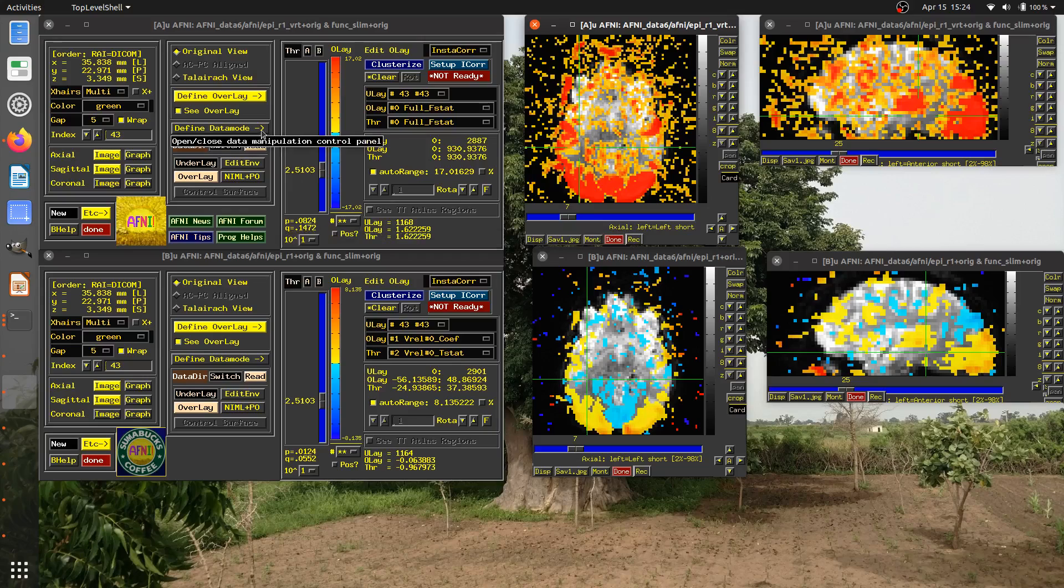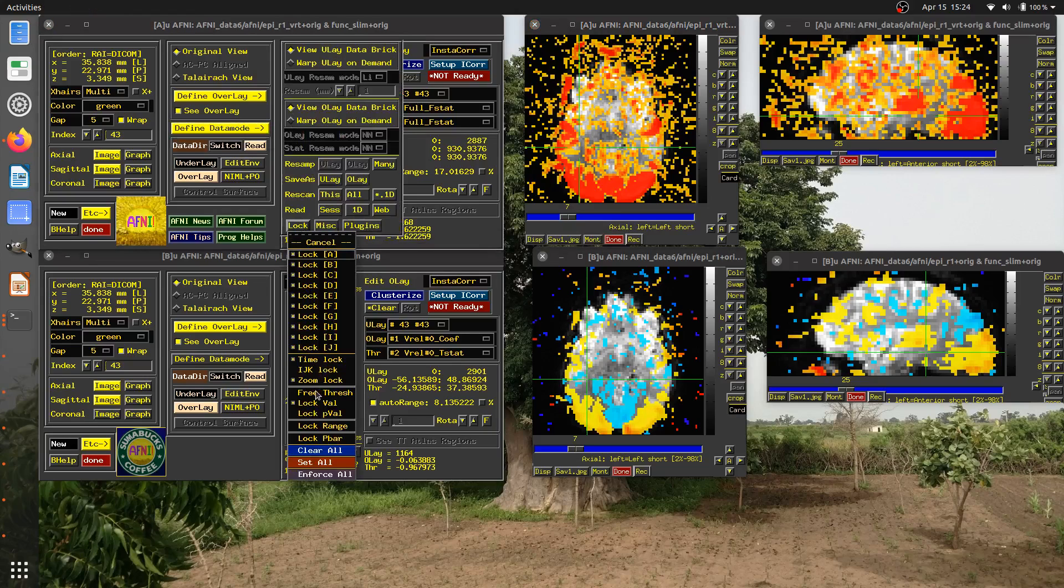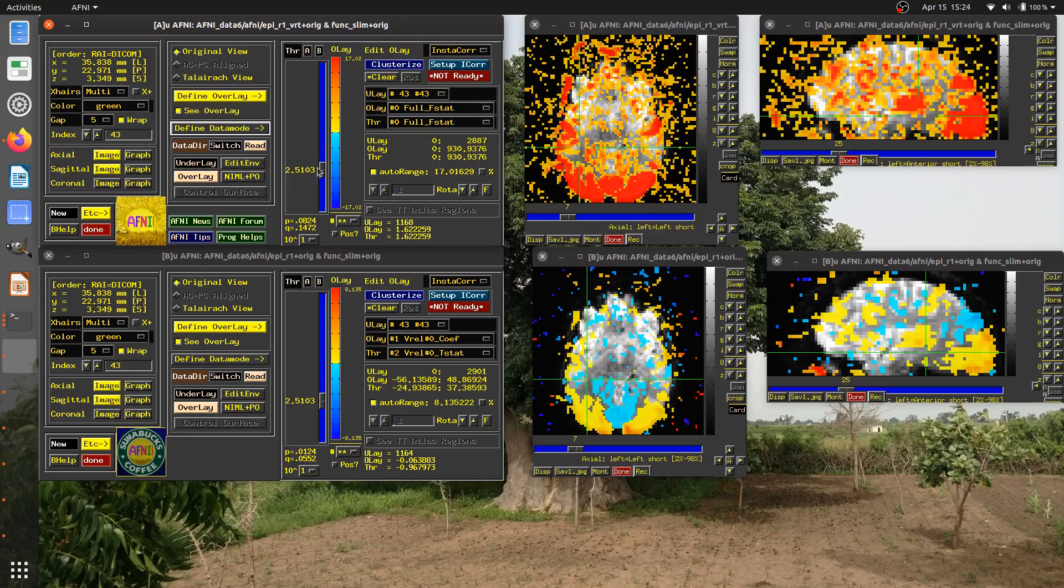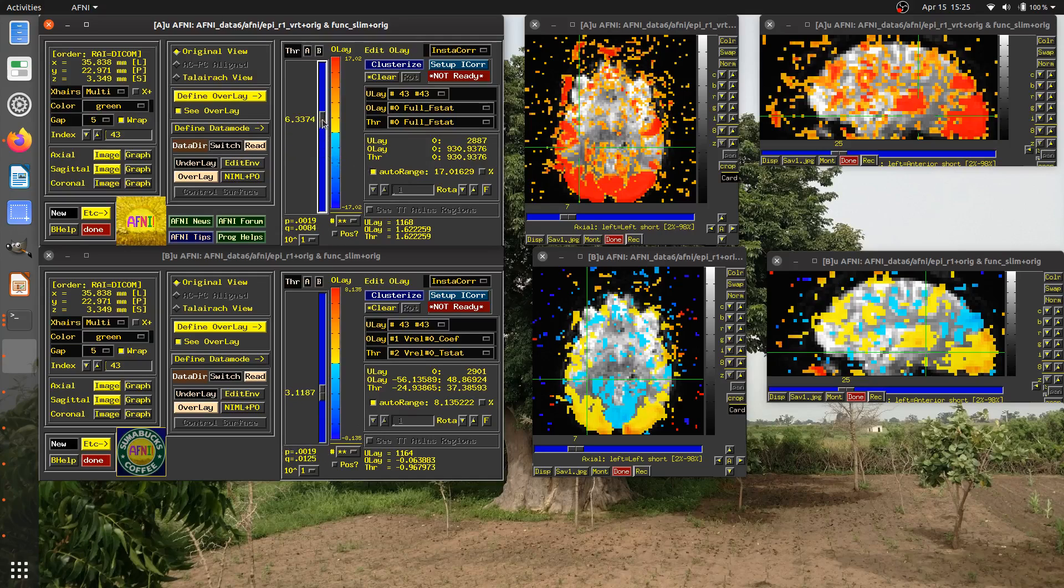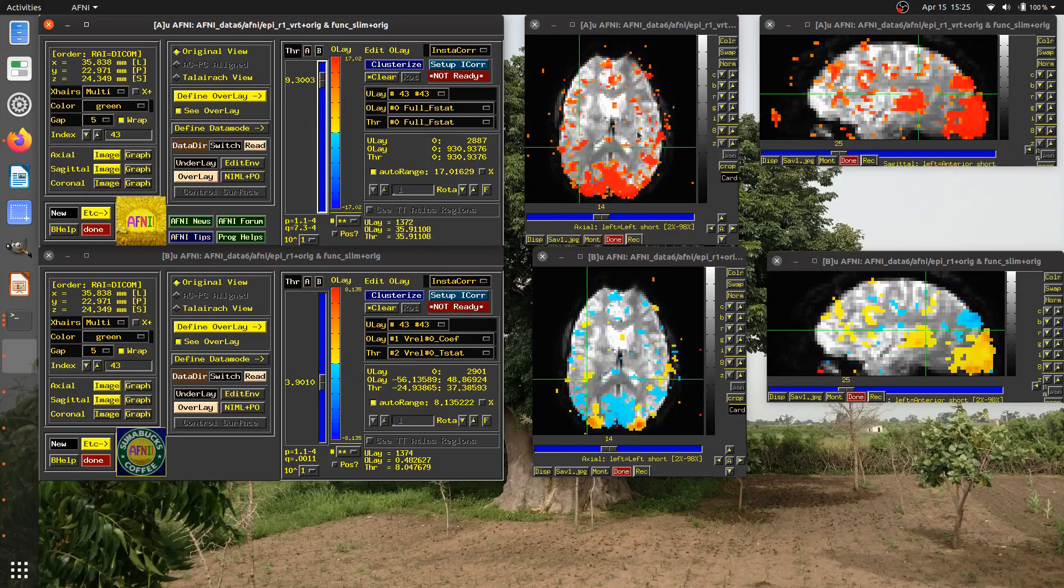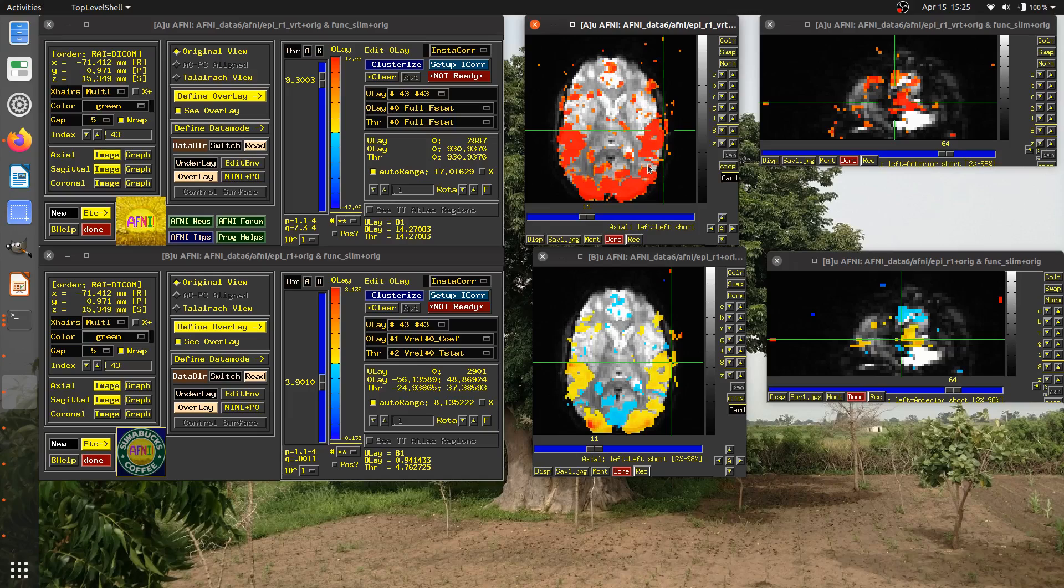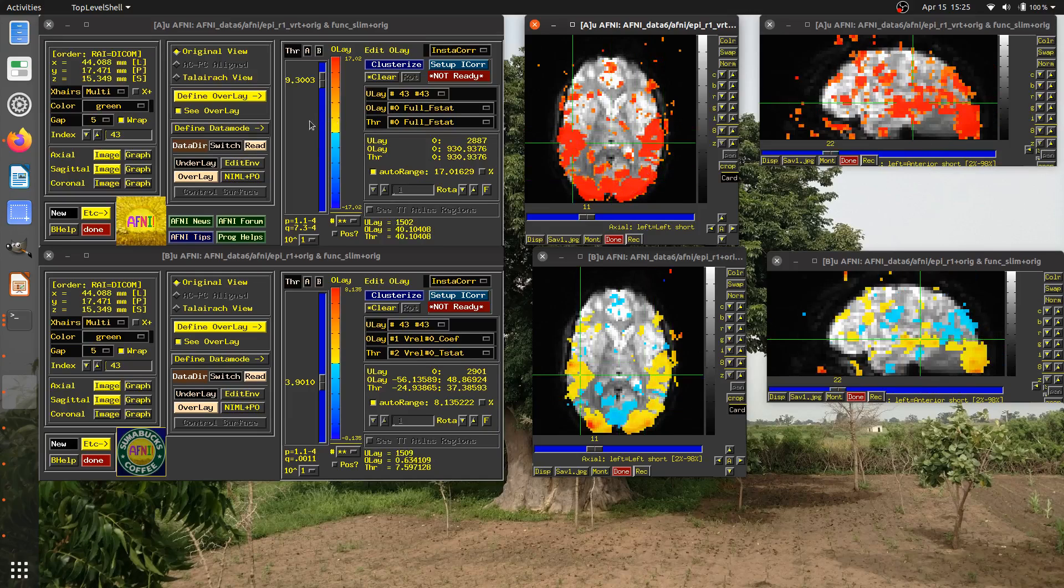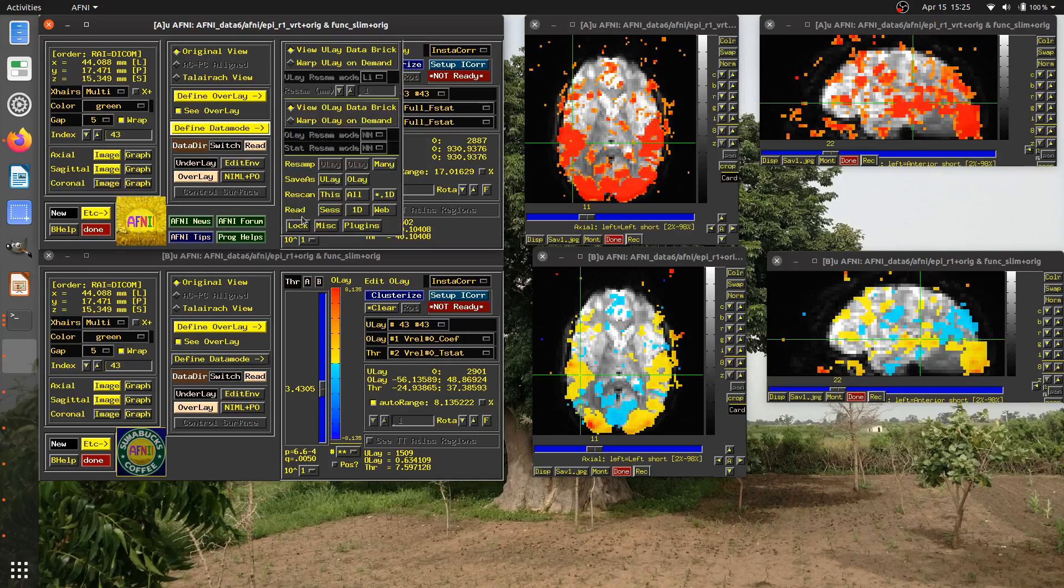Well, if I wanted to, I could ask AFNI to lock together, not the threshold value, but the P value. Now, when I change the threshold here, look at the threshold value here is four in this dataset and 2.38 in this dataset. But if you look at the associated P value, it's the same P value that I'm thresholding at in each of these datasets. So if I want to lock together two different statistics, and it doesn't have to be from the same volume, now I'm locking together the threshold by P value. So again, there are different choices about how I lock together the thresholding part.